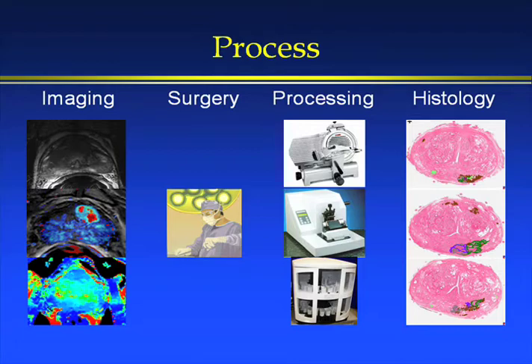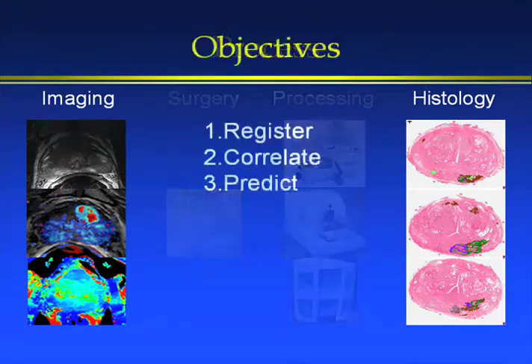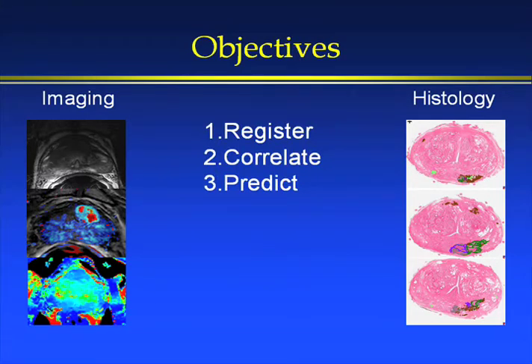surgery, after which the prostates are formalin fixed and histoprocessed, digitized at high resolution. And what you're seeing here, these little colors, are the careful annotations of the pathology that are done by our team, indicating the foci of cancer and also the Gleason grade, so the aggressiveness of each of the foci that are found. So we are collecting this very rich data set from each of our subjects.